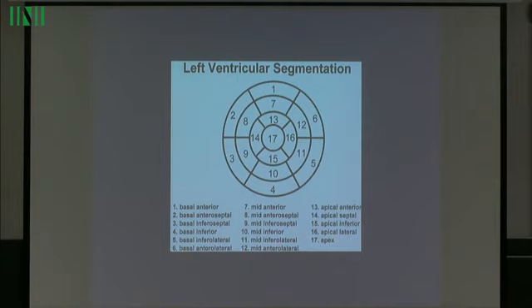And I have to stress here, as a clinical physicist, somebody who works on the front line of data collection, reducing spatial resolution in MRI is criminal. It takes us so much effort to increase spatial resolution. We fight against limitations caused by signal to noise. Once we acquire it, we don't want anybody to do any smoothing or any reformatting, okay?